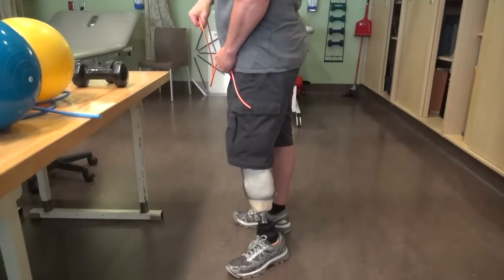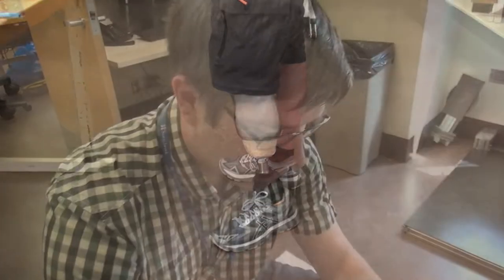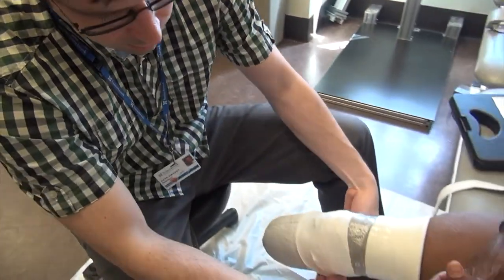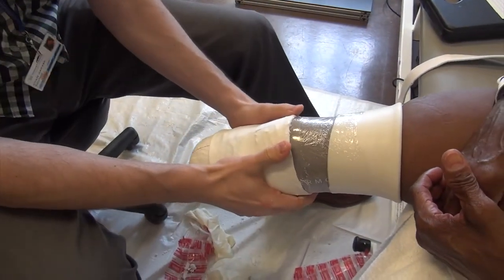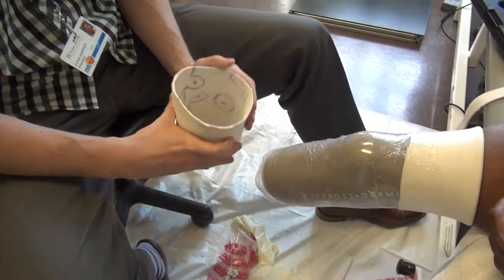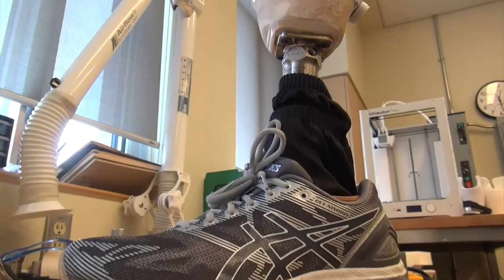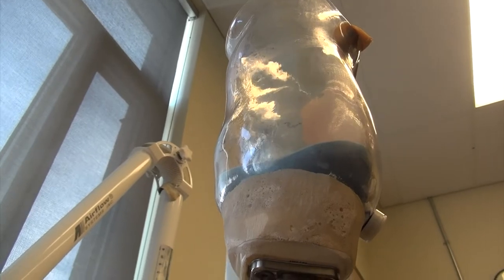For amputees, sockets are a critical part of any prosthesis, supporting their weight and movement. But they often have to be modified or remade several times if the initial fit isn't right, and to adapt to the changing shape of the patient's limb, says physiatrist Dr. Amanda Mayo. It's a multi-step process, each one taking about eight hours to complete by hand. Prosthetics is made very manually — we take manual casts and the prosthetists and technicians have to do a lot of fabrication, so it takes a long time. We're trying to see if we can make things more efficiently for patients and use 3D printing in the prosthetic space.